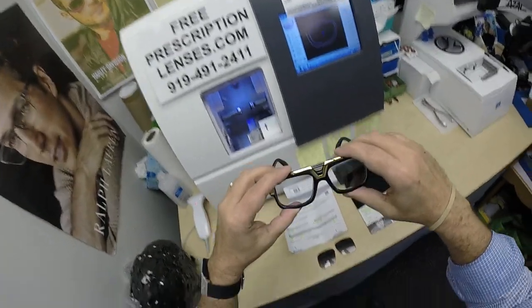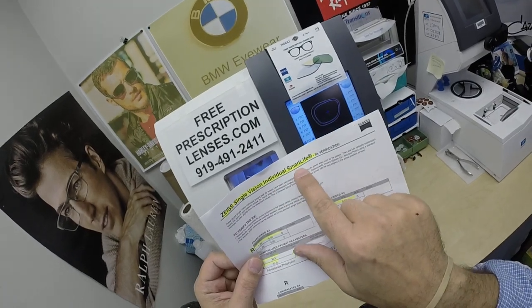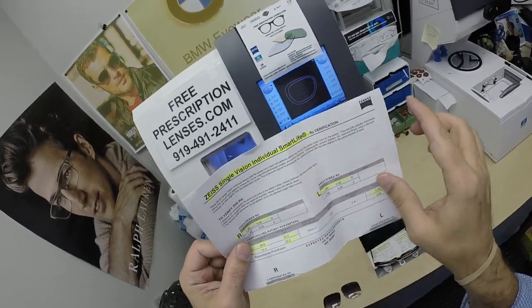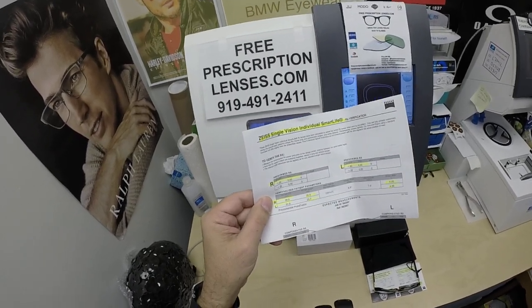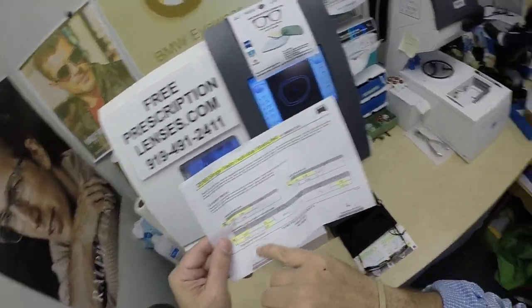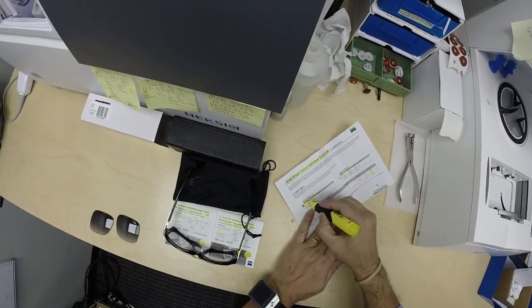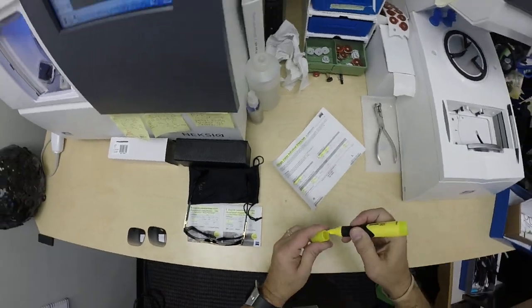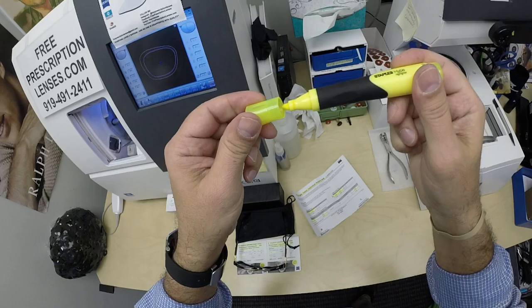He got Zeiss Single Vision Smart Life Individual — or Individual Smart Life as they call it. Mispronouncing things is kind of my thing. I've highlighted the prescription. I highlighted above it — let's see if we can get it dead on there. And if you guys missed any of that, let me recap.